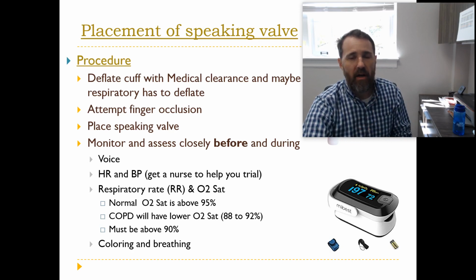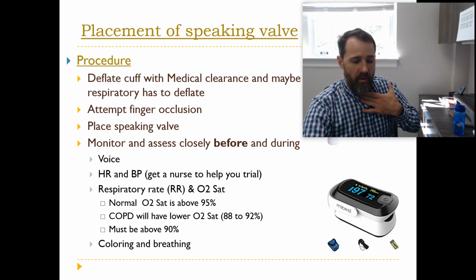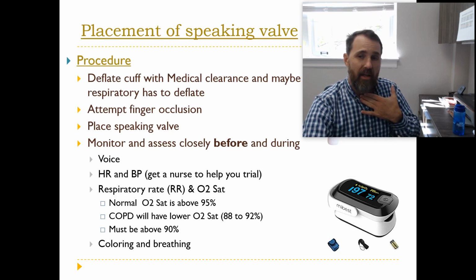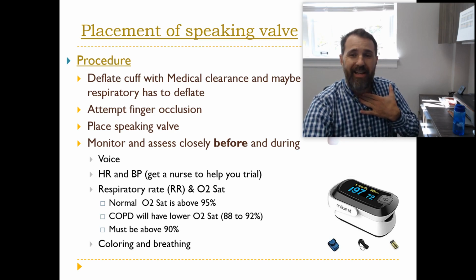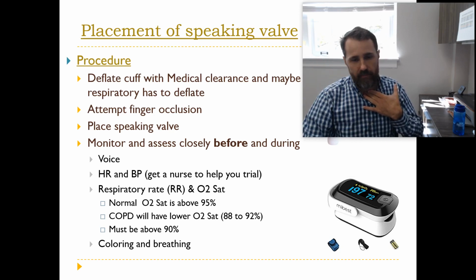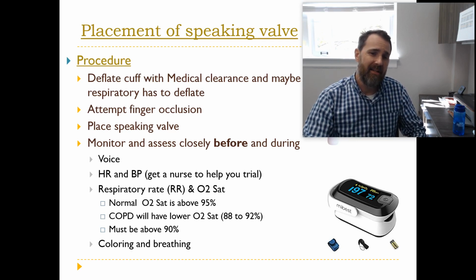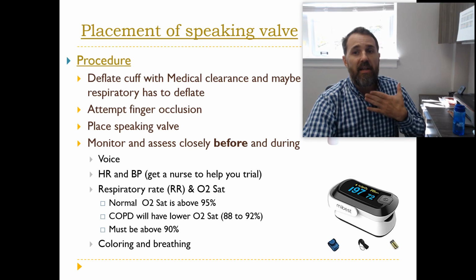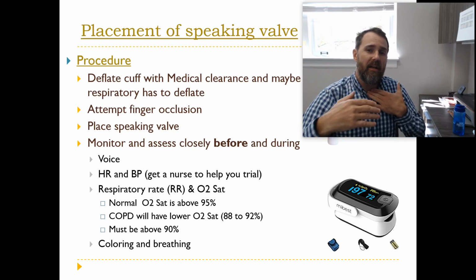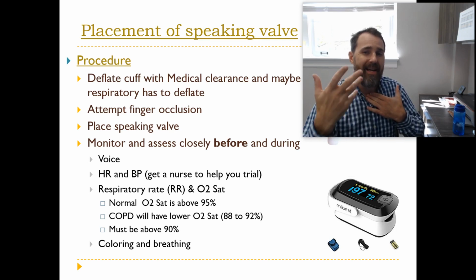And if they seem to be tolerating that situation, then you want to attempt occluding the tracheostomy tube with your finger and seeing if they're able to inspire and expire, not using the tracheostomy tube. And maybe you want to start with asking the patient to take a deep breath, to take a deep inspiration, and then covering it, and then having them expire through the vocal folds, through the natural airway.